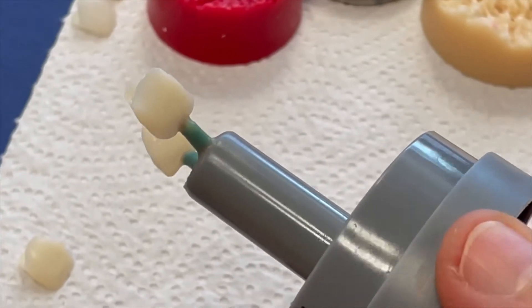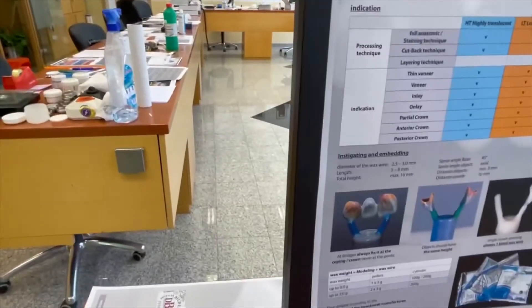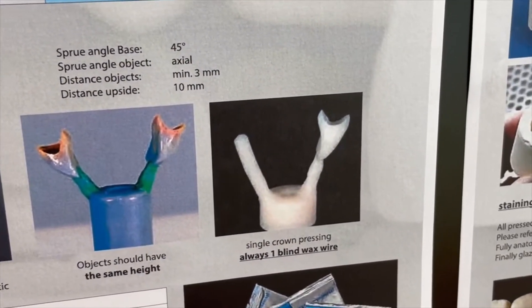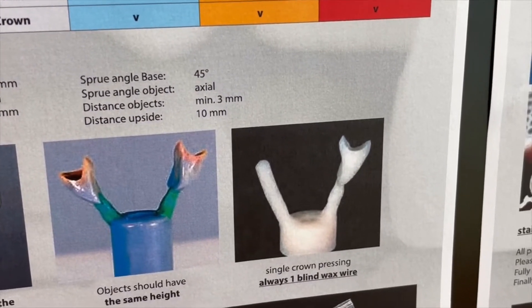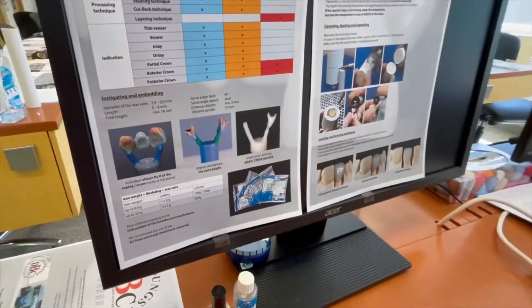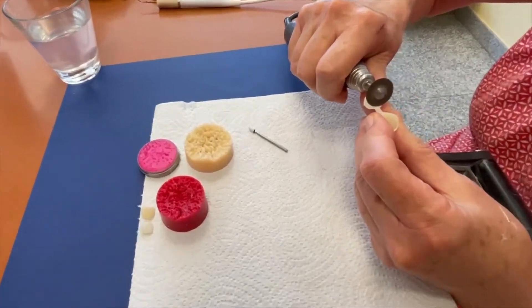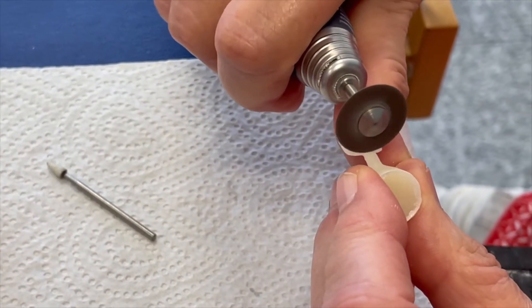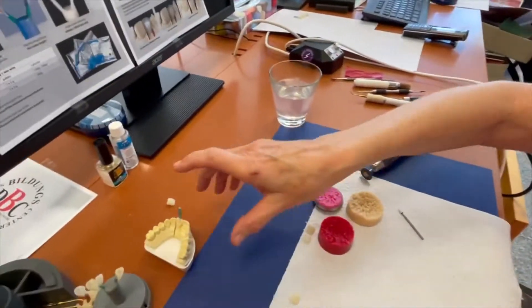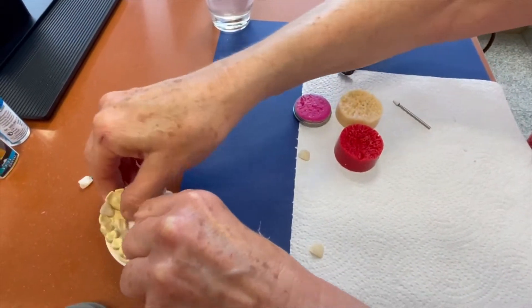Now we fill the investment material. For the investment material, please let me show the step. As we discussed yesterday, if you have only a single crown it is necessary to have a blind channel without the crown — this is always necessary. We press the ceramic and come back with the pressed ceramic crown to the working place. Once the crown is cut back, we can go ahead and set the crown on the model.